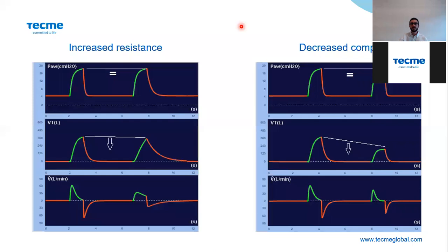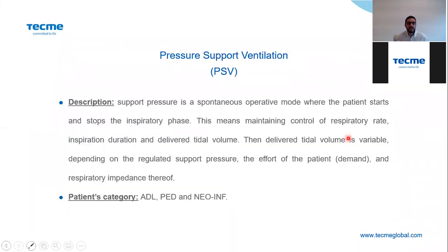Let's continue with the next ventilatory mode. The next one is pressure support ventilation, or PSV. This is a completely spontaneous ventilatory mode, where the patient starts and ends the inspiratory phase. So the patient will decide when to start and when to finish the inspiratory phase.